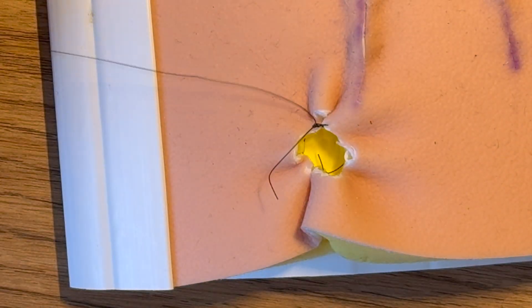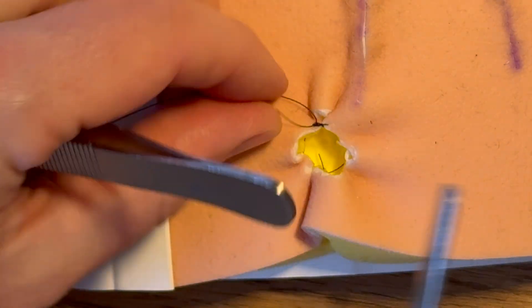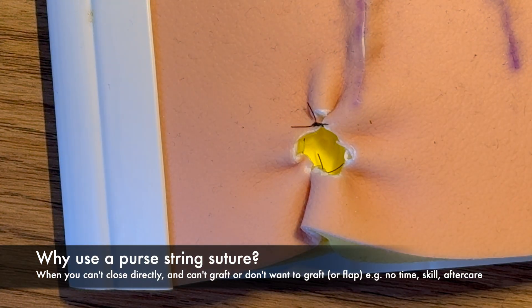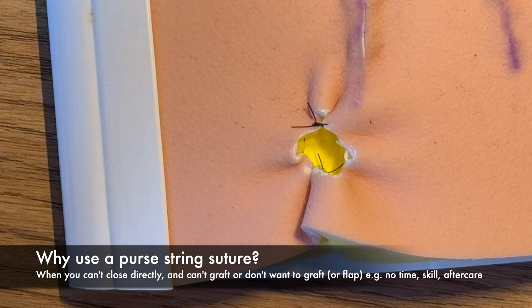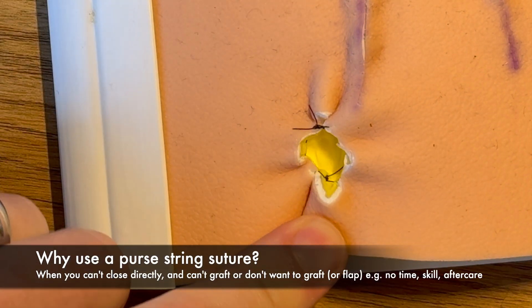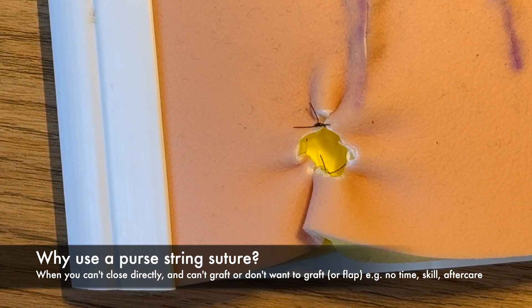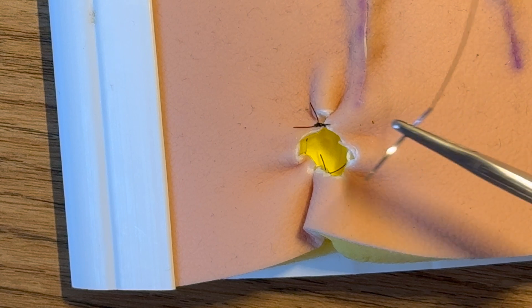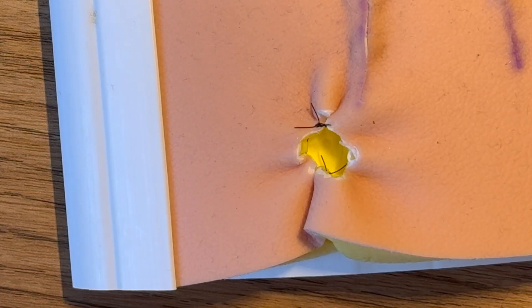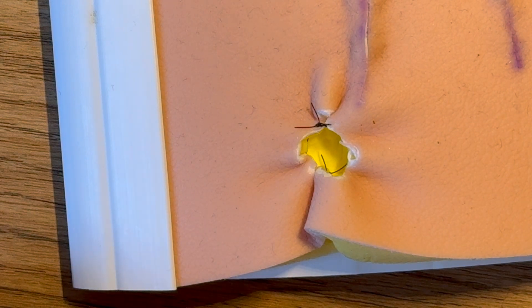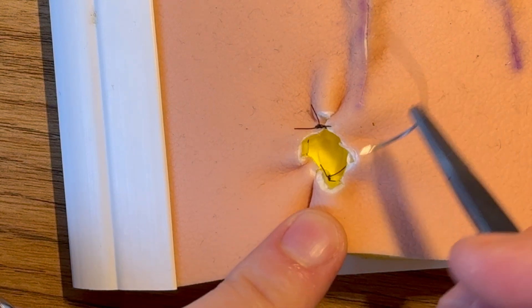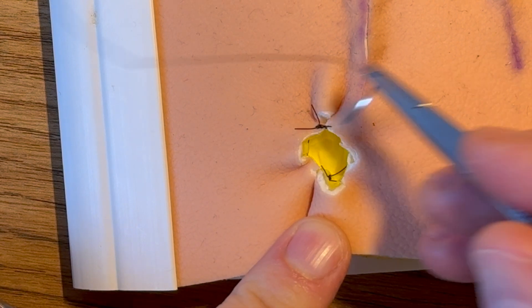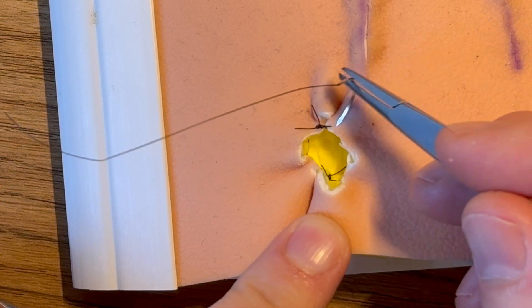And often that's the priority for patients you're doing this on, which brings me on to saying why do we use this technique? And basically you're going to use this if you can't close something. So if you've got a wound that's just a bit too big to close directly, maybe you don't want to do a skin graft or you haven't got time to do a skin graft but you want to excise the lesion, or the patient can't cope with the aftercare or whatever.